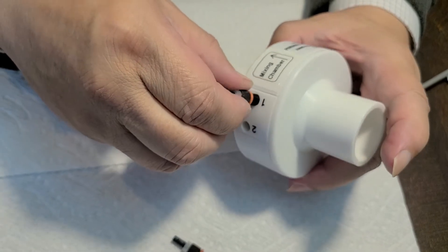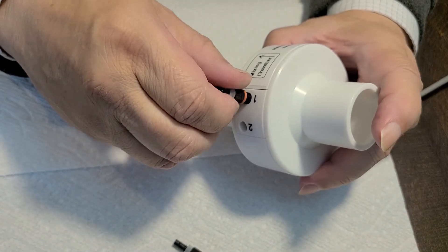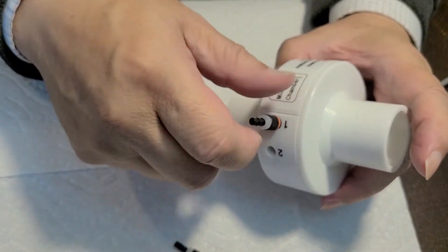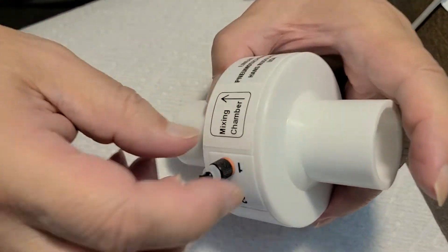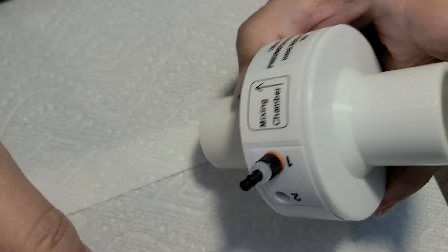So first gently screw in until the orange o-ring hits the surface. Then turn 90 degrees.